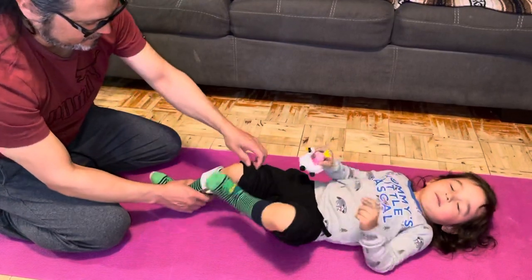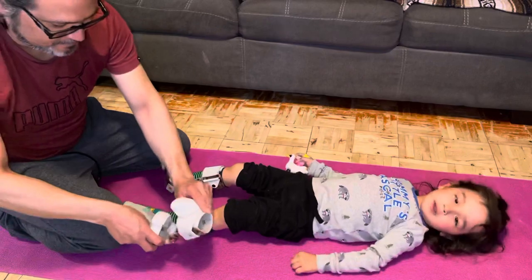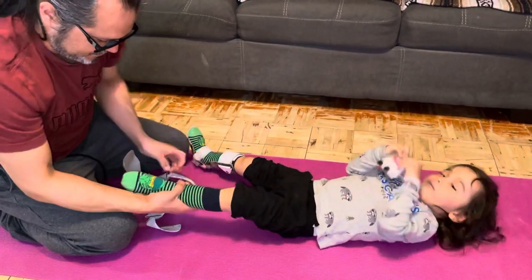You just want to double check and make sure everything's okay. Then on to the next one, Ryan. Just check his socks again, make sure they're okay.